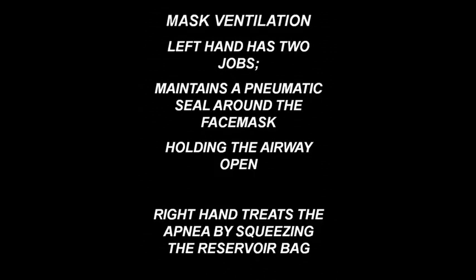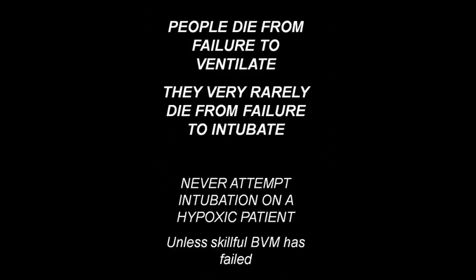In this situation, mask ventilation for more experienced providers is as follows. You will maintain a pneumatic seal around the face mask with the index finger and thumb of your left hand. You will hold the airway open with the ring and little finger of your left hand, and the right hand will treat the apnea by squeezing the reservoir bag.